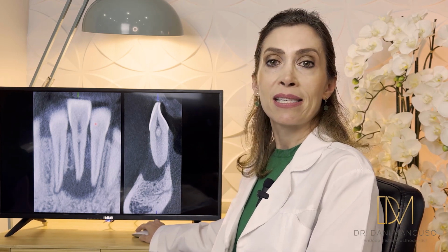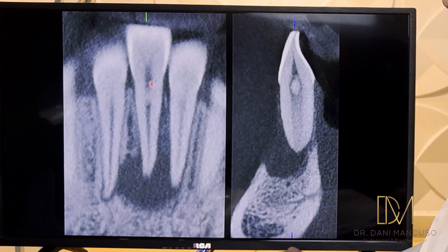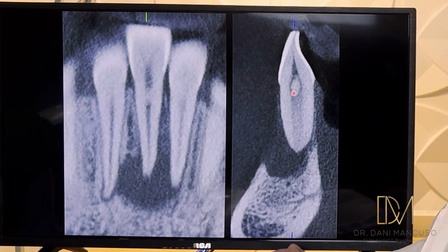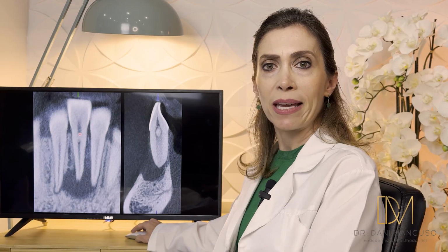And if you are in doubt, it's better not to do any root canal treatment on that tooth. Do the obvious one first, mainly for young patients. Otherwise, you end up removing vital pulp sometimes, so it's better not to touch it. The obvious one is the tooth in the middle of the lesion, the one which is necrotic, the one which was slightly discolored, and as you can see here, there is a little bit of pulp calcification in the middle of the tooth, which is quite normal in cases of trauma.